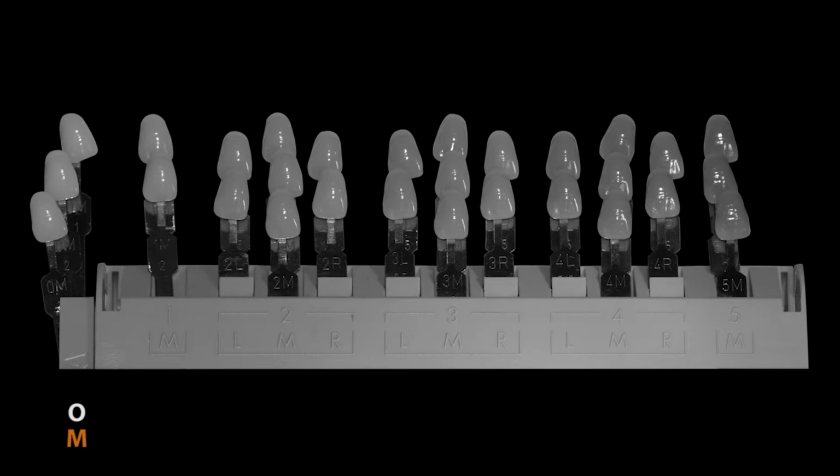As you move to the right of the shade guide, you're going to notice a 1M bracket. That 1M, there's a 1M1 and a 1M2. Those two shade guides are the same amount of gray, but they are darker or grayer than the O shade guide, and so forth as we move to the right. The bracket of the 2 shade guide. Now I have a 2L, a 2M, and a 2R. You're going to notice that that 2 group, you cannot tell the difference between those shade guides when I take the color and the chroma away, and you only see value. They all look the same.